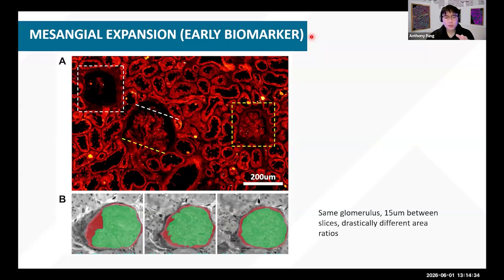We're very fortunate to have glomeruli in 3 distinct planes. So we have a medial section because you can see that arteriole, but we also have very polar sections, and they'll all have a very different ratio, like the glomerulus to the overall Bowman space.